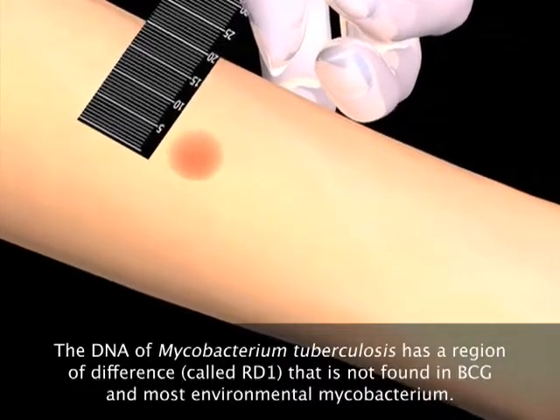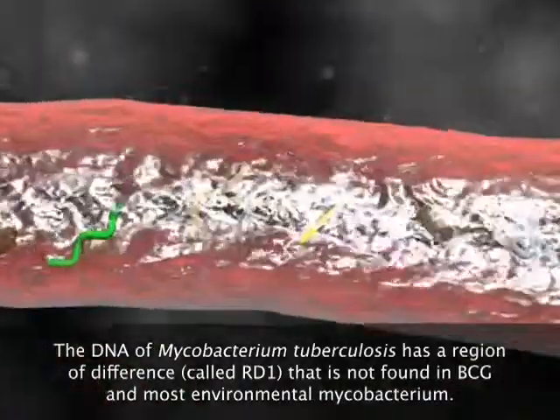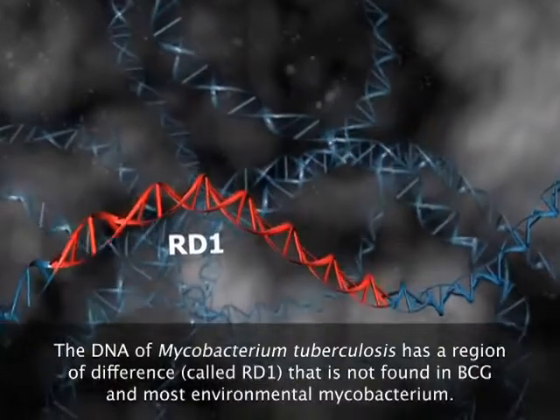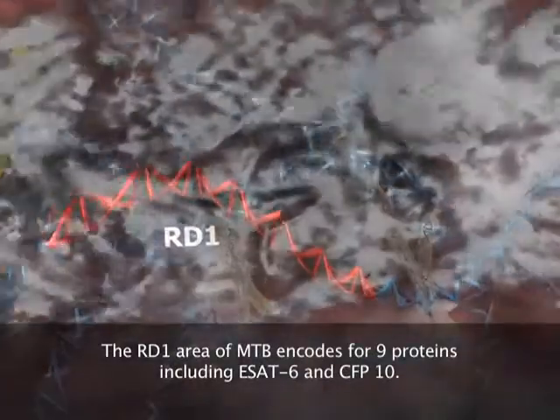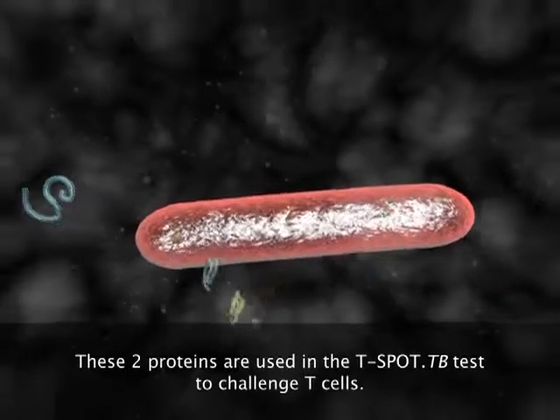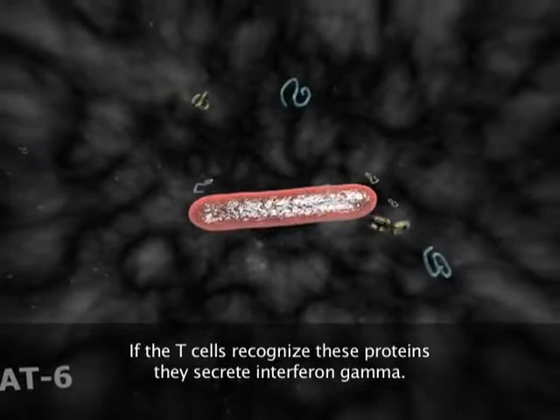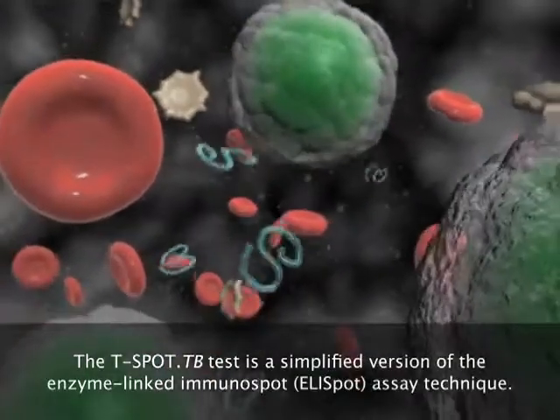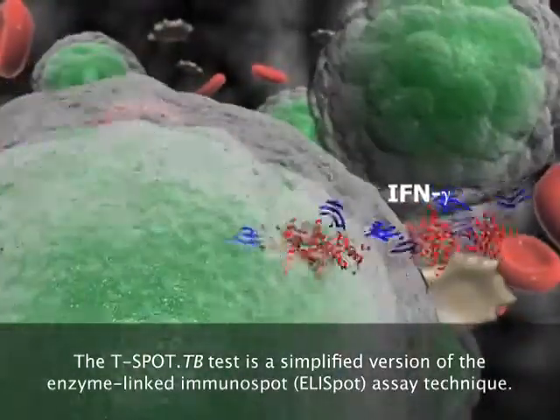The DNA of Mycobacterium tuberculosis has a region of difference called RD1 that is not found in BCG and most environmental Mycobacterium. The RD1 area of MTB encodes for 9 proteins, including eSAT6 and CFP10. These 2 proteins are used in the T-spot TB test to challenge T cells. If the T cells recognize these proteins, they secrete interferon gamma. The T-spot TB test is a simplified version of the enzyme-linked immunospot ELISpot assay technique.